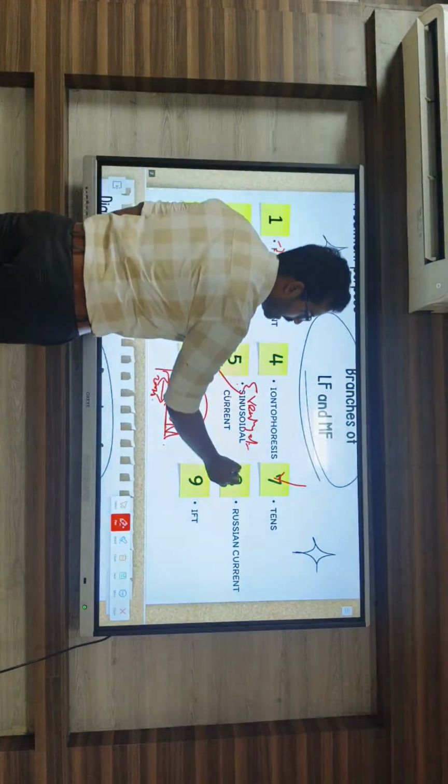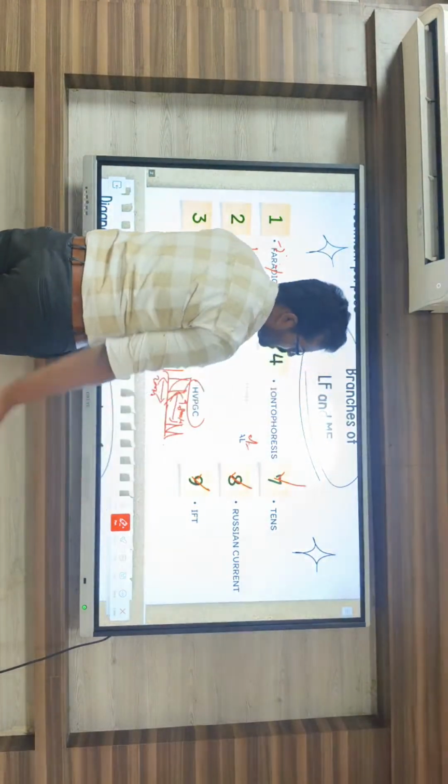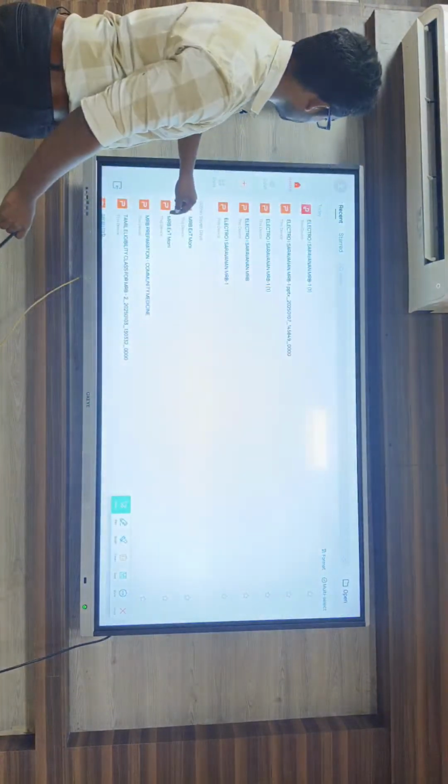So hereafter the Russian current and IFT come under the medium frequency currents.